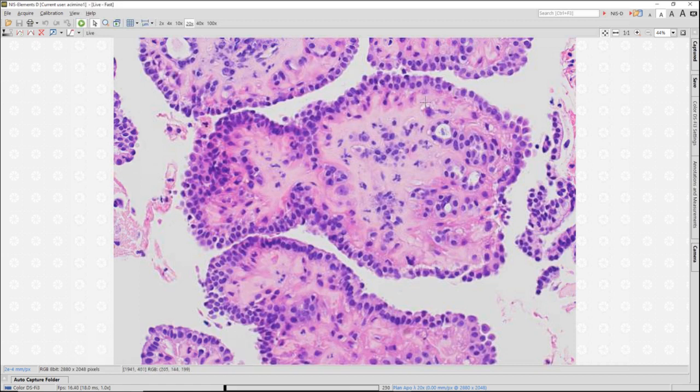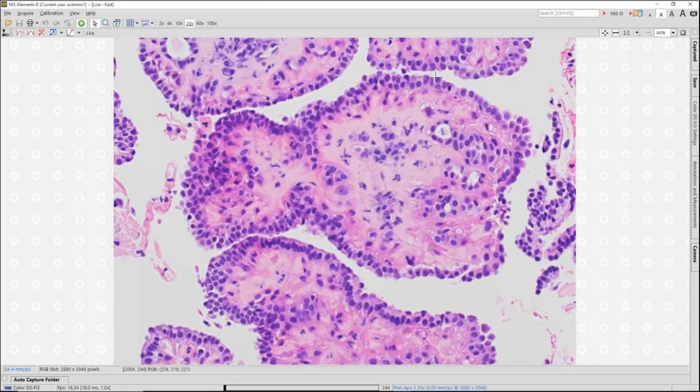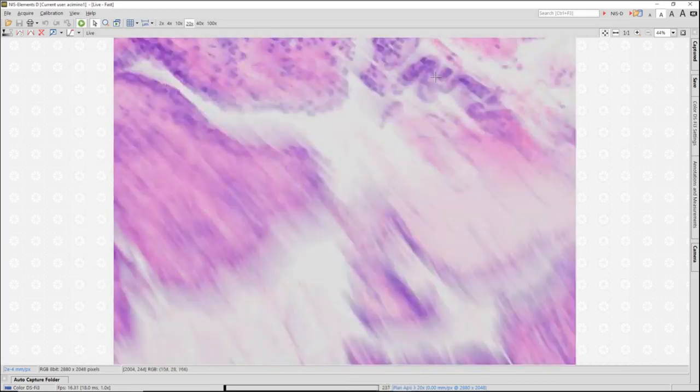Myoepithelial cells in papillomas can also take a variety of forms. In this particular case, we see abundant pink cytoplasm that is taking more of a myoid or muscle-like differentiation. They can have abundant clear cytoplasm or be more spindled. So no two papillomas are the same. The epithelial cells and the myoepithelial cells can take different morphologic appearances, but they should both be bland and relatively single, kind of single layer, till we get into the hyperplastic proliferations.